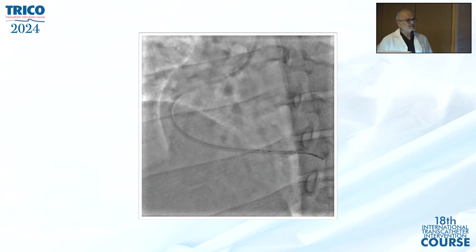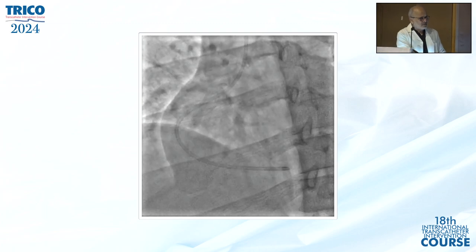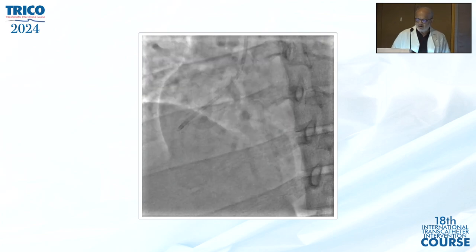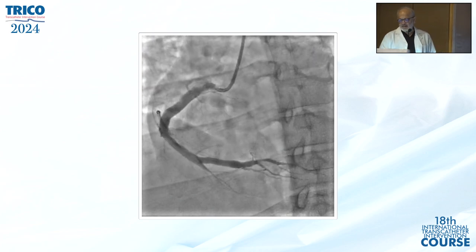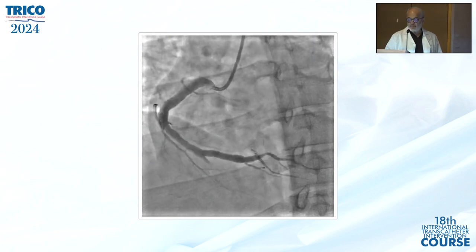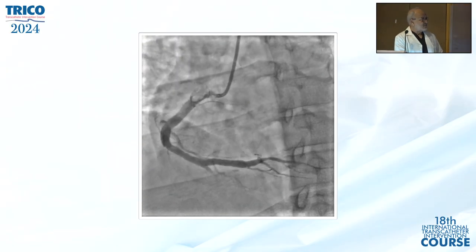This is the guide catheter inside the coronary. And slowly, and counterclock rotation, 50 cc syringe, complete negative suction. Here, this time, I did not allow the things to come out. We again came out with this thrombus. And then, backflow, a good backflow of the blood, 50 cc, 70 cc blood came out. And then, we again injected and landed up with this result. And then, I never wanted to chase that small PDA. Even if it is big, I don't want, because I have done enough. We thought that we have done enough, and the patient did well.